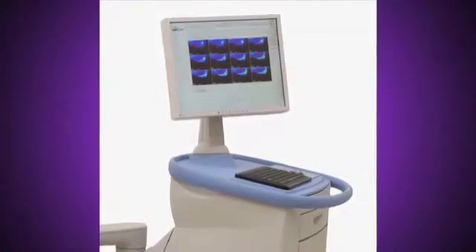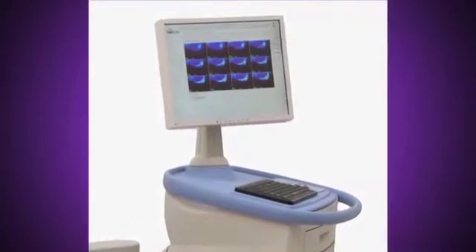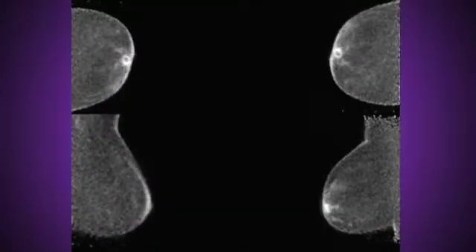With PEM, 12 tomographic slices per view are acquired, creating a 3D molecular imaging perspective of the breast, allowing visualization of lesions as small as 2 mm.